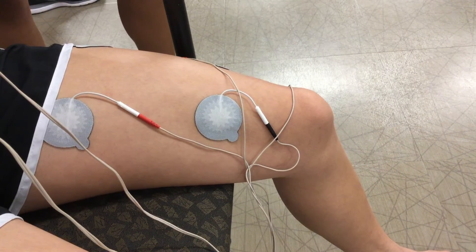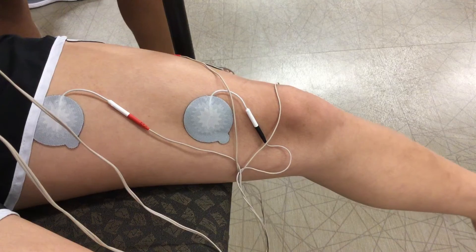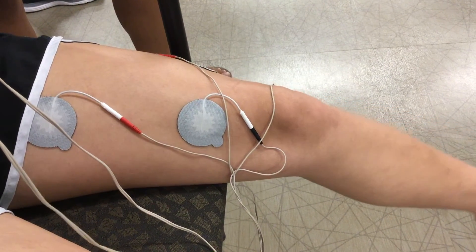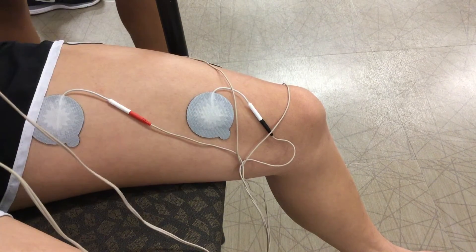What intensity are you at? Currently at a 20 for intensity. And this is our patient's tolerance level.